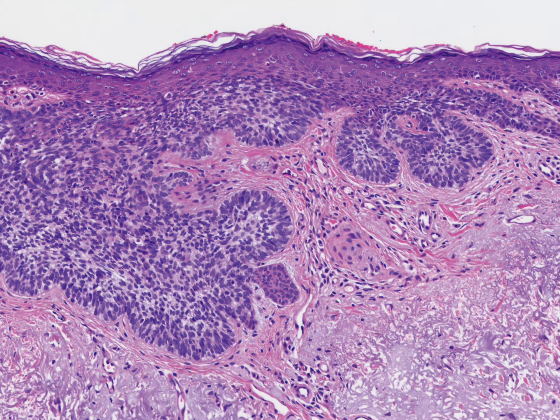This is another common variant of BCC, also known as superficial BCC, which is characterized by epidermal connection into the papillary dermis.